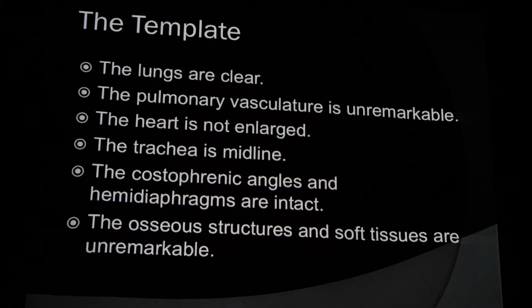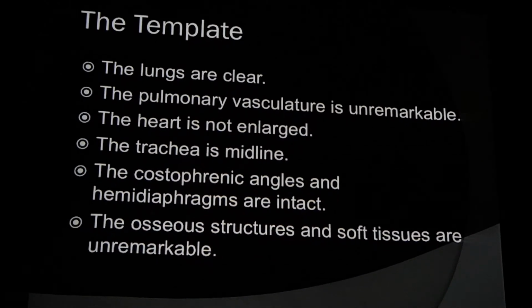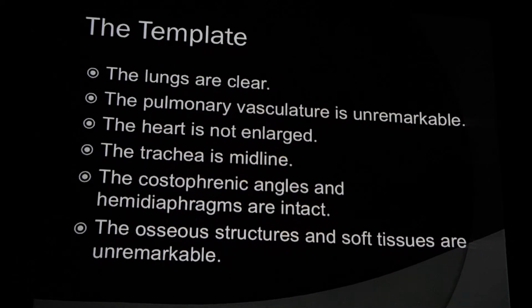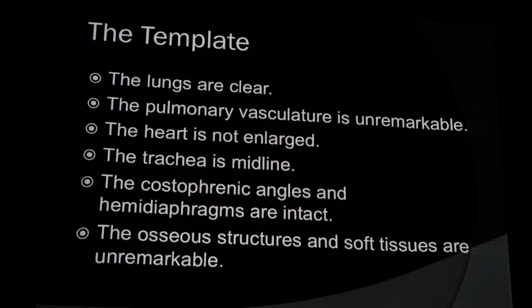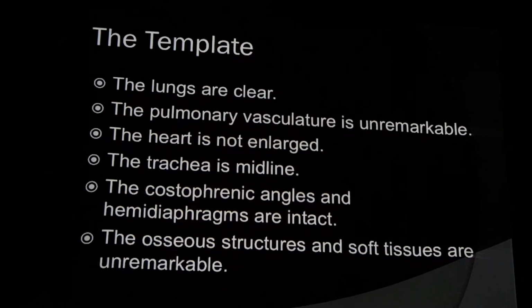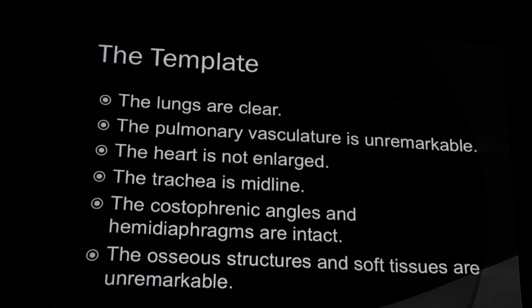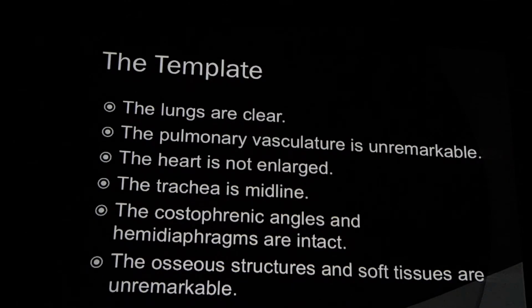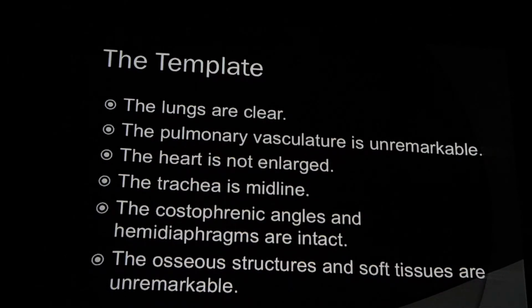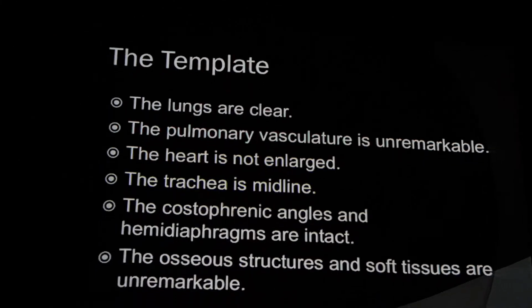Some radiologists give shorter templates. But for beginners, I think a longer template is better because it will force you to look at all these structures. So you have a checklist. The lungs, check. Vasculature, check. Heart, check. And so on, to make sure that you don't miss anything. As you become more experienced, you can shorten your template down to what needs to be done.